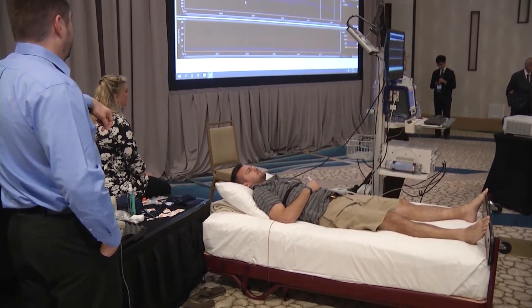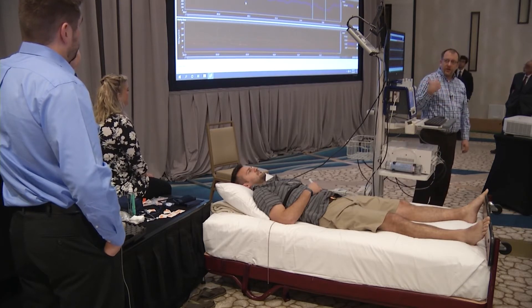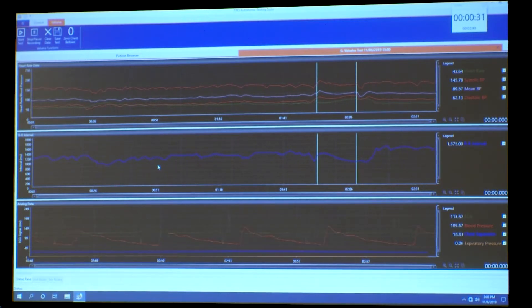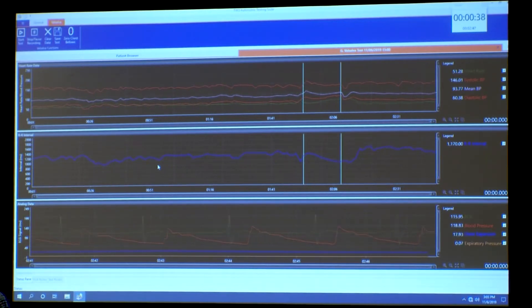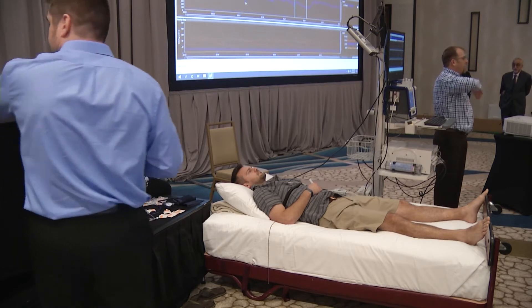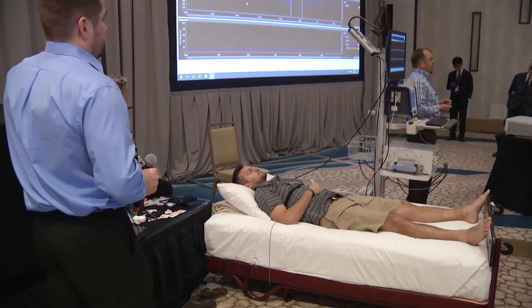This is done a little differently from what you might see in the literature. We actually make three marks, not just two. We make one when we ask the patient to take a big deep breath in — you'll see a little bit of change that happens with that. Then we don't make that second mark until they hit at least 20 millimeters of mercury, and that's when our timer starts. So we don't start the timer as soon as they start blowing; it's once they're above 20. We really want them to get up to a steady pressure and hold it there — not going from 40 to 20 to 40 to 20.